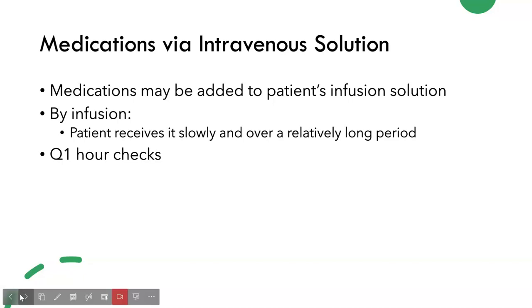You also have to make sure that whatever medication you're inserting into the solution is compatible. So this is not necessarily done anymore, but if it is done, you have to make sure it's labeled at the top and the amount of medication is put on there. It's important to put that on just our normal saline or our regular IV fluids. We still need to label them and note that there is nothing added to them.